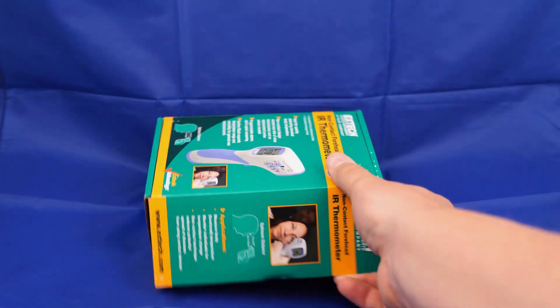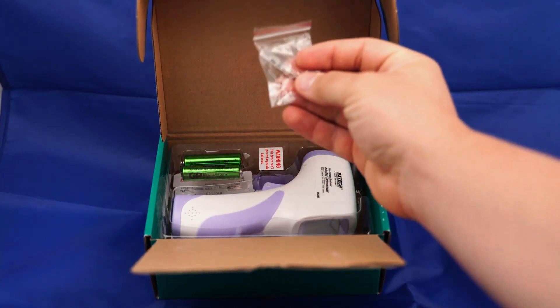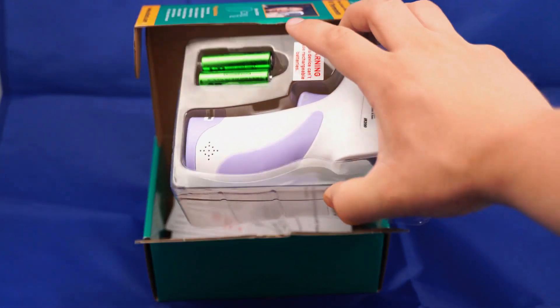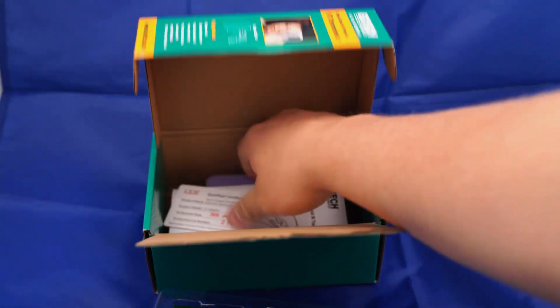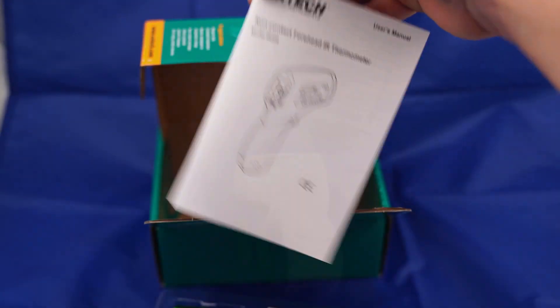For the initial setup, inside the box you have a screwdriver with a screw, which is used to lock the battery in if needed. Next, we have the actual unit and batteries included, as well as a soft carrying pouch, certification sticker, and a manual.